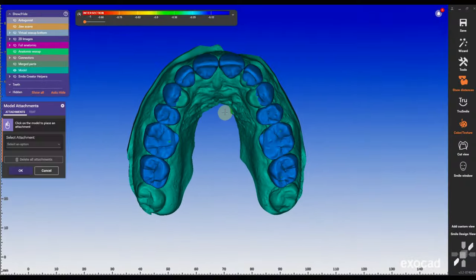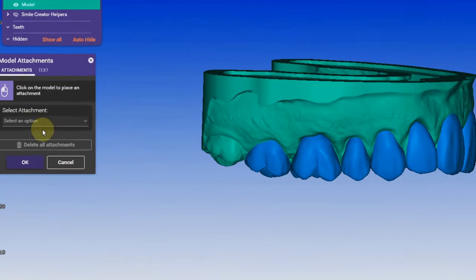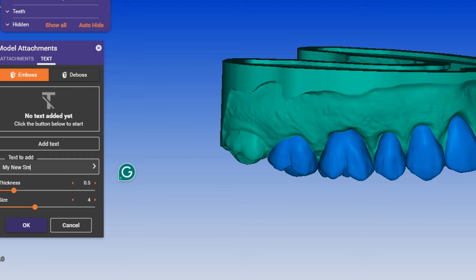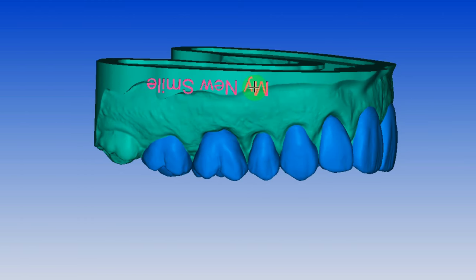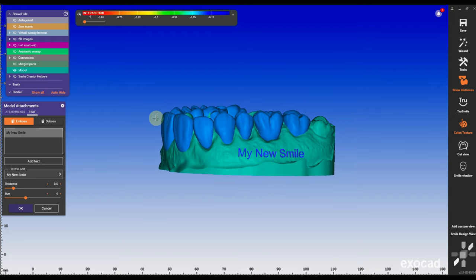Under attachments, you can add a text. In this case, I'm going to call it 'my new smile.' You can choose between embossed and debossed, and I think 'my new smile' is a really catchy name. If you print this on a model with your company logo or with a patient name — for example, 'my new smile for patient X' — it makes it really personal for the patient.